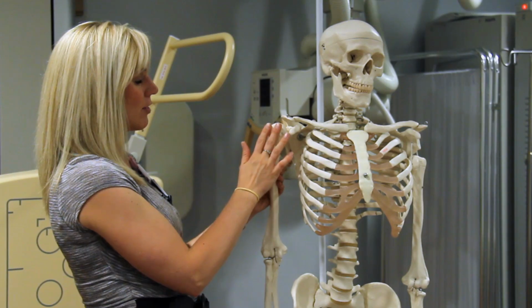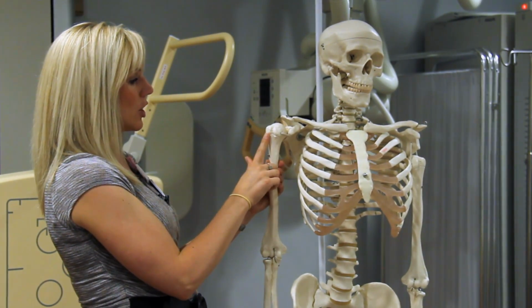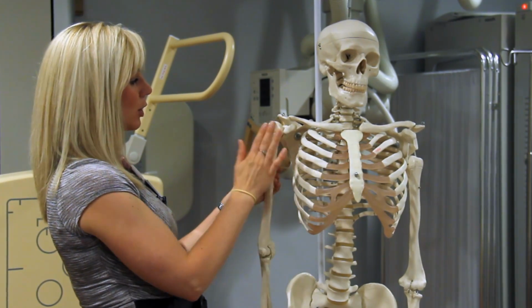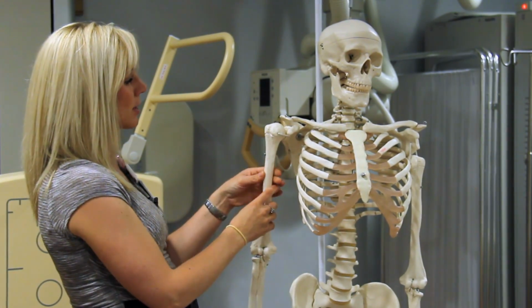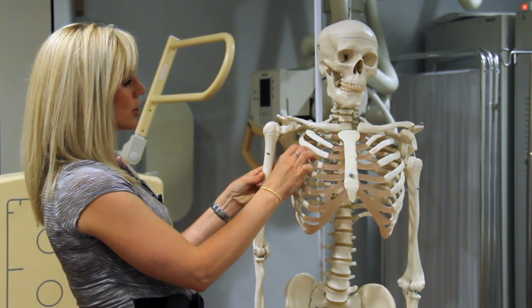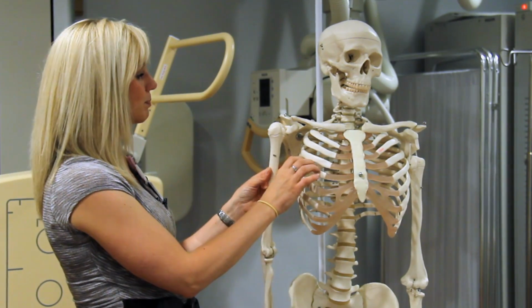So the next thing, and very, very important, we use these a lot for positioning and for critique of images, are the greater tubercle and the lesser tubercle. The greater tubercle sits a little bit more laterally, and in an external projection, we see that in profile on the lateral aspect. The lesser tubercle sits more on the medial side, so when we do internal rotation, we can see that in profile on the medial aspect.